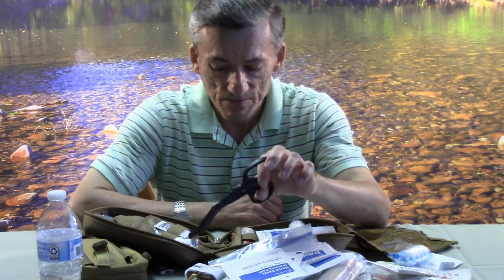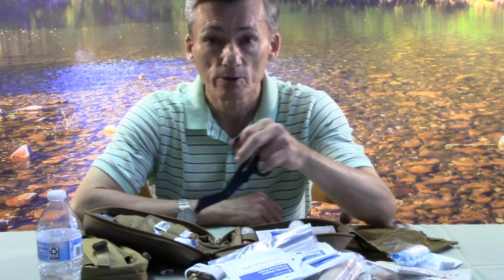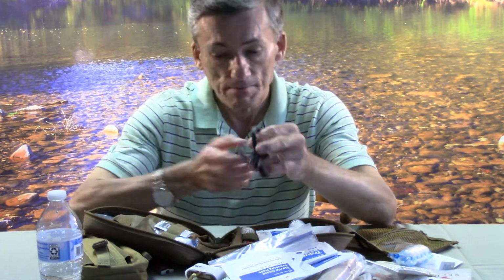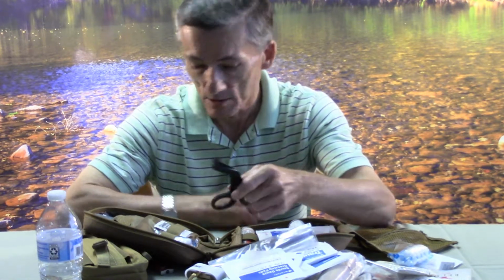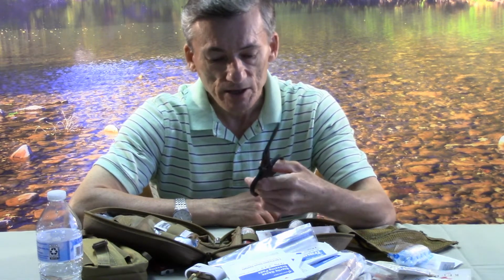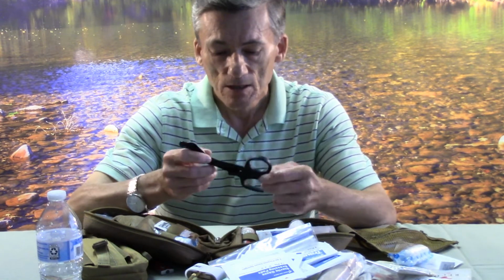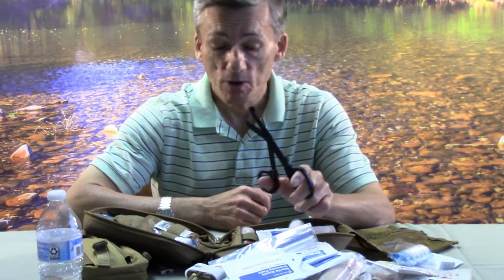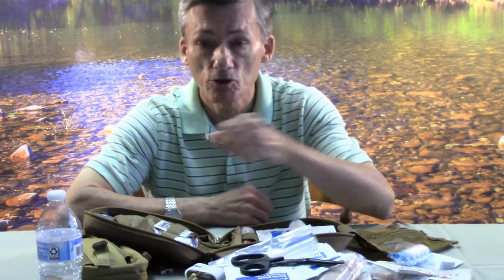Now these, again, if you're getting into a situation where a person's got a severe wound, a lot of times it's going to be under their clothing, and you can't access it without actually cutting the clothing off that's covering it. These trauma shears, that's what they're for. I picked these up on Amazon for under $7. I believe $6.95, something like that. These are actually stainless steel, not very expensive, but there are some that are even like $2 or $3.